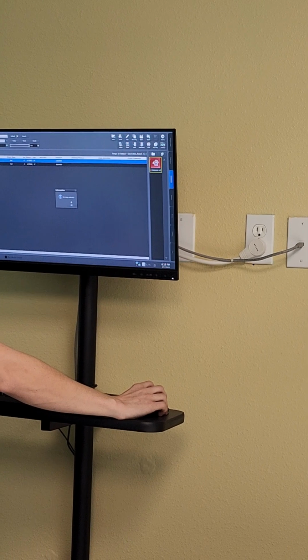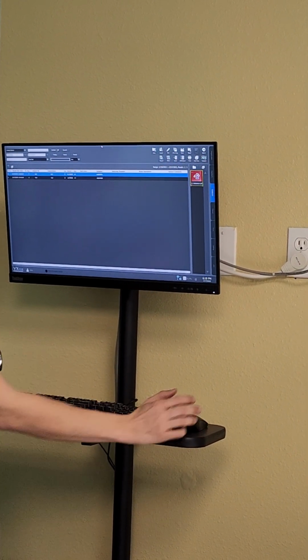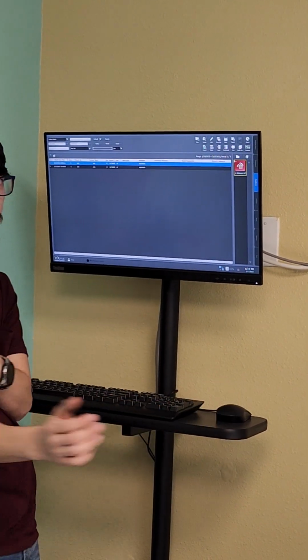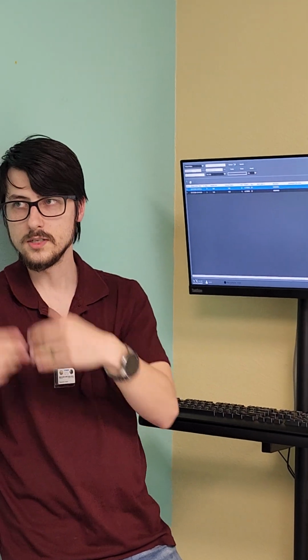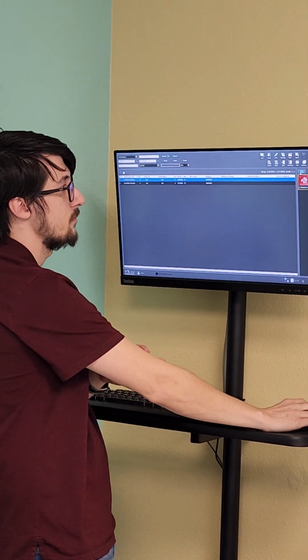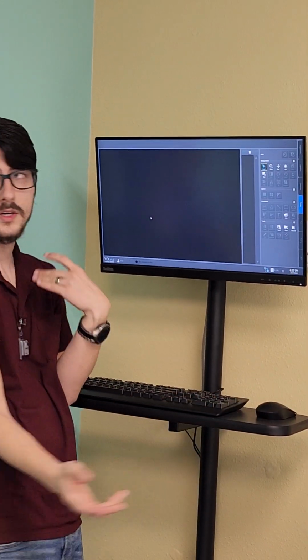Oh, no images, because we rejected them. You can play with it. Export is, let's say you wanted to save it to a disk for the patient to send with them. You can save it to a disk or a flash drive, whatever. That's pretty much it for this tab. It's pretty simple.